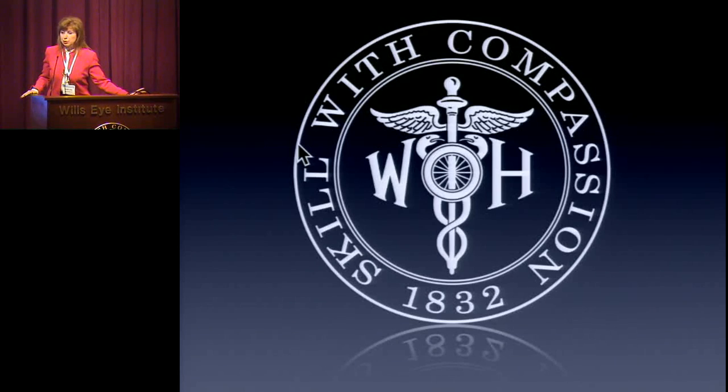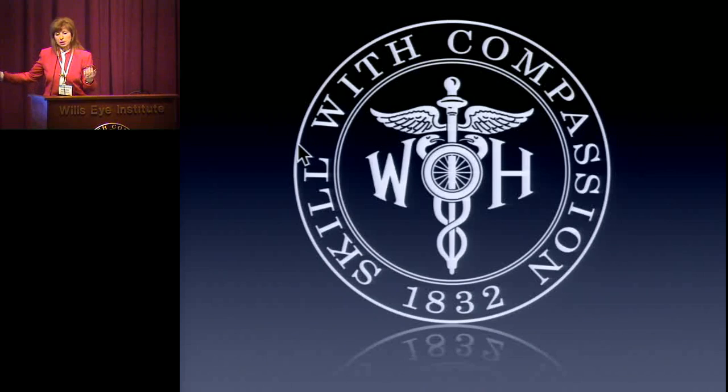However, that being said, and I agree completely about stereo disc photos, because I have had our disc photos scanned in and our computer systems have come and gone, but the pictures remain. And no matter what, we have the original photos. And what I find very helpful is when I see a patient originally, we print out an extra digital copy of their photos. Why? Because they travel. Travel today is nothing. They start in Philadelphia, they wind up in California, and then they go abroad. But their optic nerve pictures always stay the same, at least at baseline. So because glaucoma is a disease of change over time, I think that's very, very valuable.